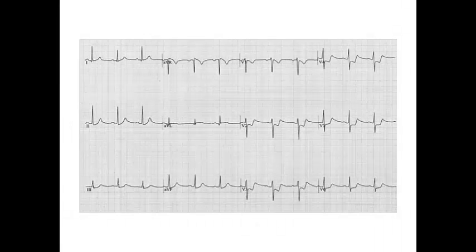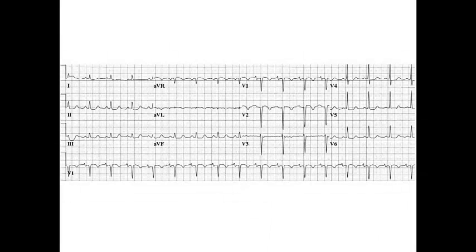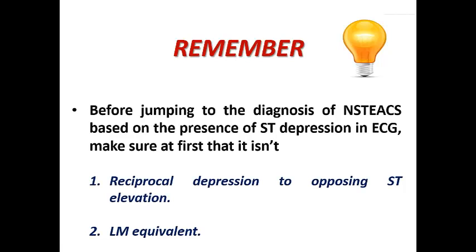In this ECG we can see ST depression in V2, V3, V4, V5, and V6, and also in the inferior leads, suggestive of non-ST elevation acute coronary syndrome. Some may note minimal ST elevation in AVR, but it is not fulfilling the criteria to be considered a left-main equivalent. In this second ECG, we can see ST depression in V4, V5, and V6, and slightly in the inferior leads, also suggestive of non-ST.